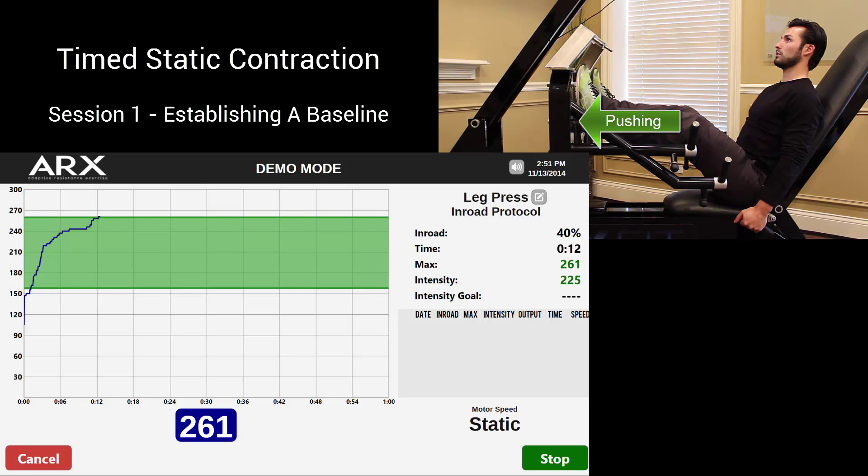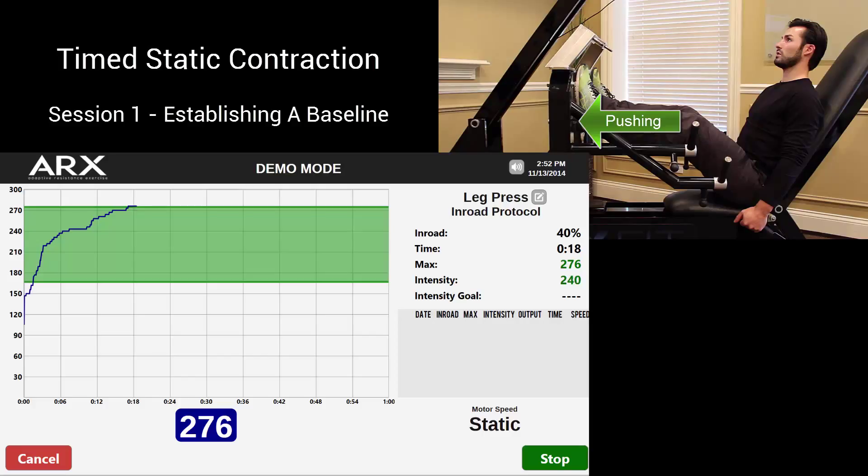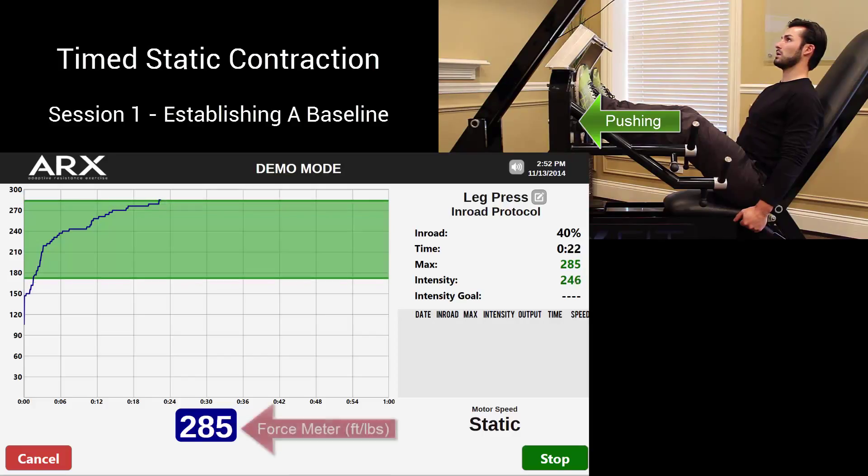During this first session, the patient establishes a baseline. Exerting only as intensely as he can while remaining pain-free, he's able to contract the muscles of the legs and receive feedback on the magnitude of this contraction and track how much force he's producing.